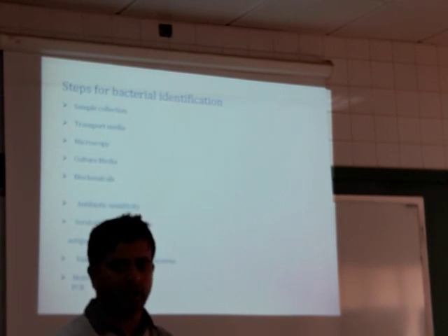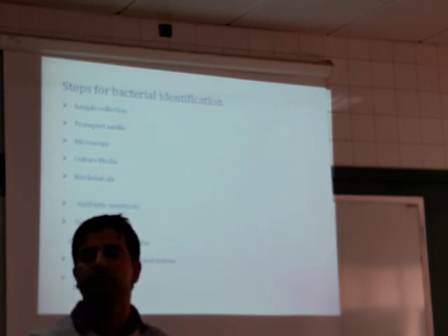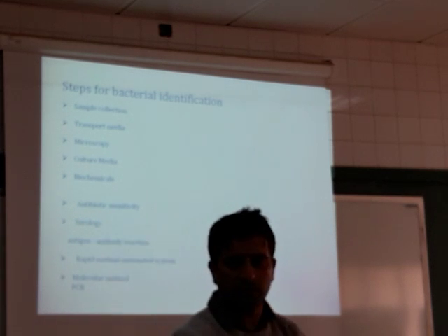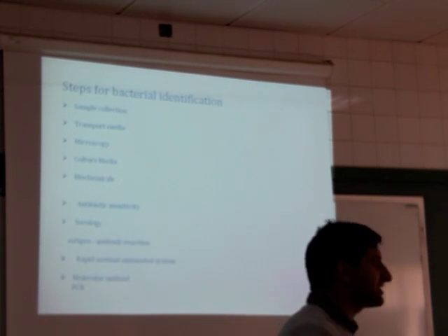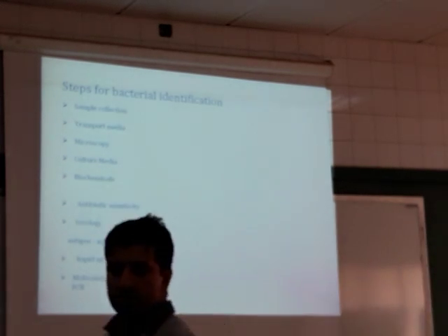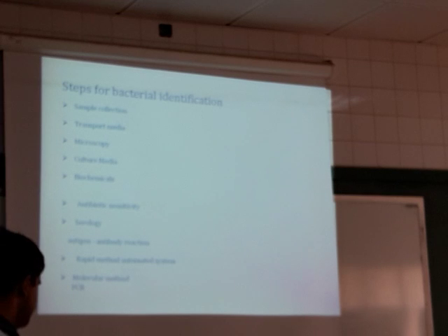After the lab finishes, you will go to your home by means of car, okay? Some will go by walking. So there is a means of transport. Similarly, when you collect the sample, there should be the transport. So what is the transport? We will see now. What are the things we can carry the bacteria in? Not for all, but for some of them, okay? Some need a proper means of transport.